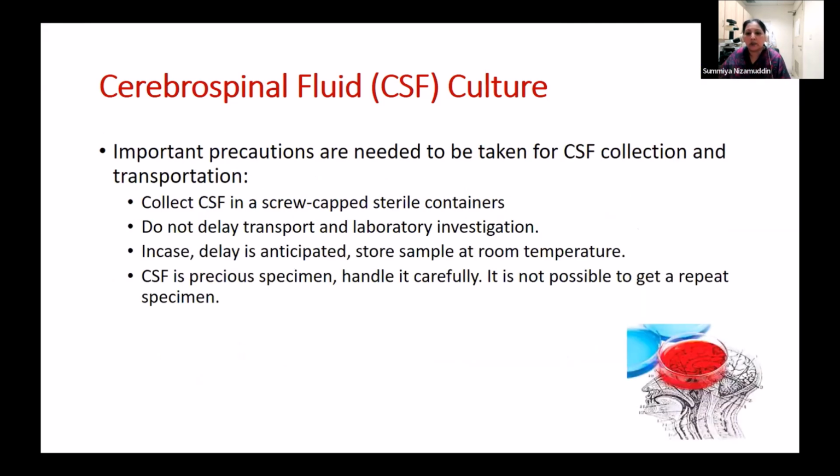Important precautions that need to be taken for CSF collection and transportation. You need to ensure that the CSF sample is collected in a screw-capped sterile container. You should not delay the transport and lab investigation. In case where a delay is anticipated, please ensure that the sample is stored at room temperature, not in the refrigerator. CSF samples have to be stored at room temperature.